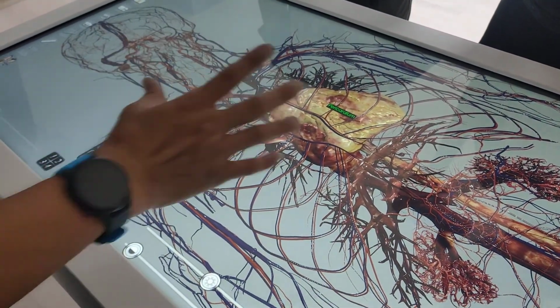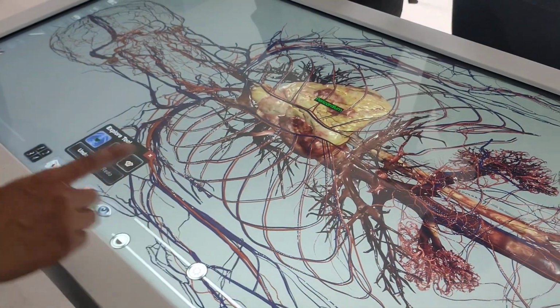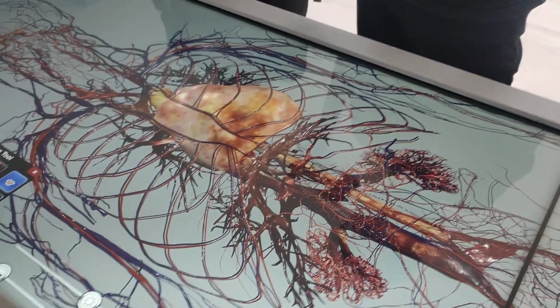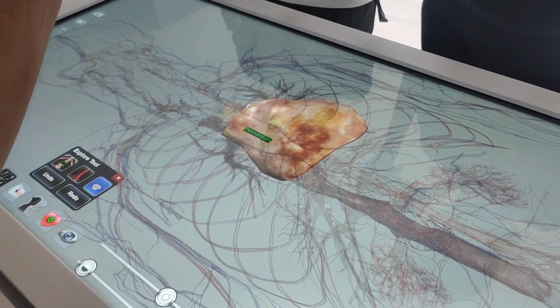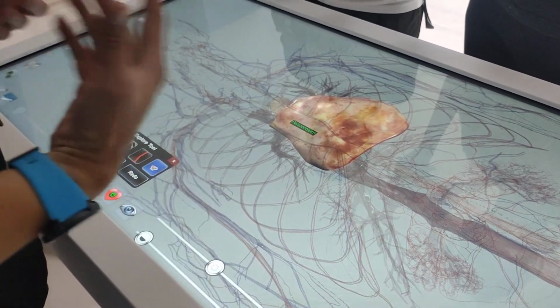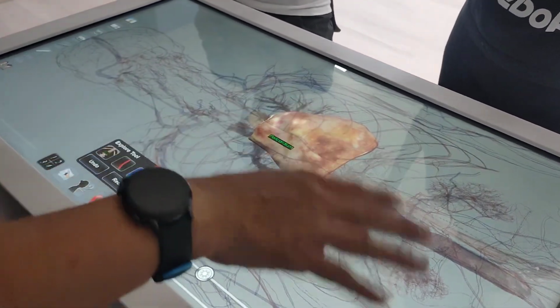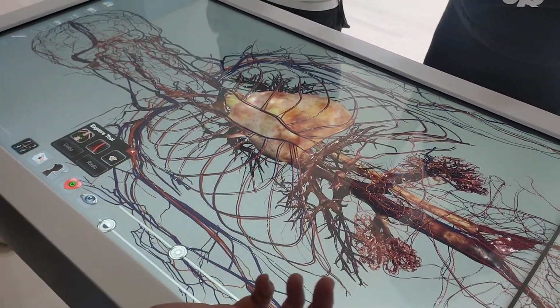It is to take out some of the tissue that you don't want to see, and you can undo, and pericardium is better. And this one is to make the pericardium, I would say, to emphasize the pericardium, but fade out other tissues or other blood vessels. Then it's coming back.